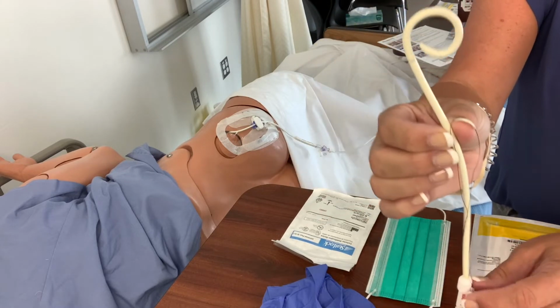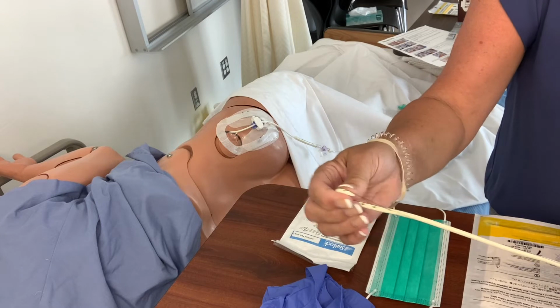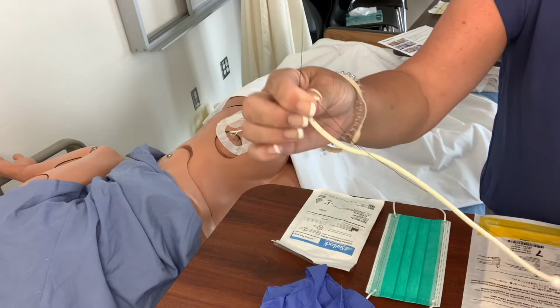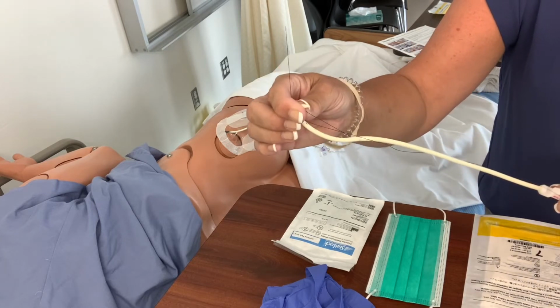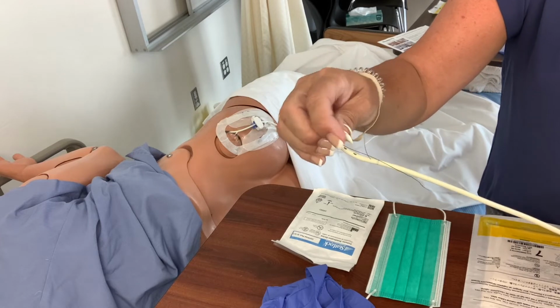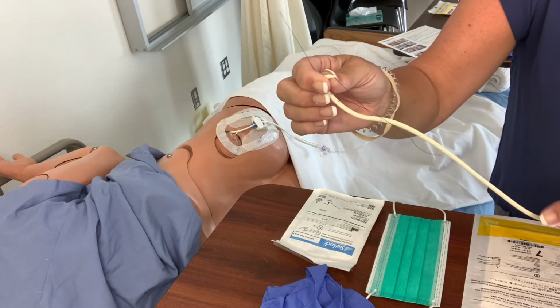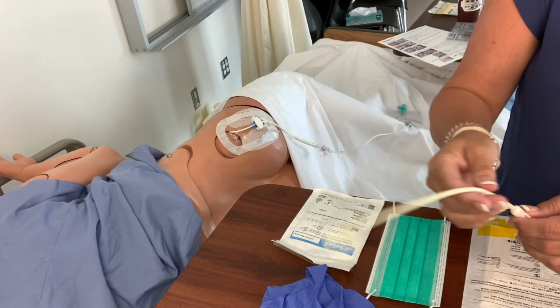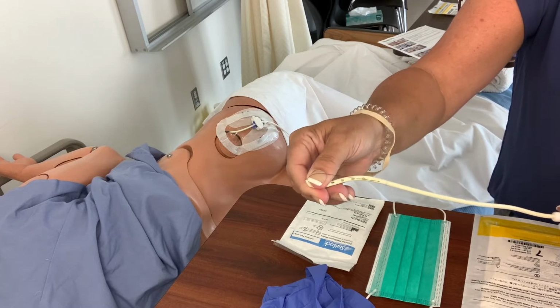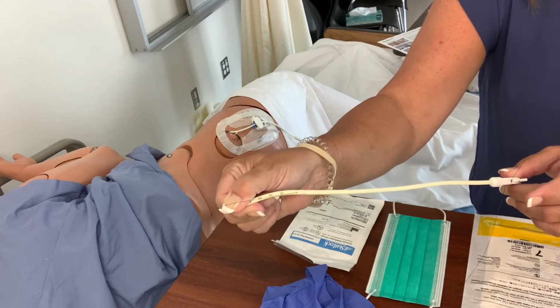It gets inserted for whatever reason the patient requires the drain, usually in ultrasound-guided areas where they can see the area they want to place it in perfectly. It's put in with something like a knitting needle, a hard device that gets inserted into the catheter and holds it more straight so that when it goes in, it can go into the location it wants to be in.